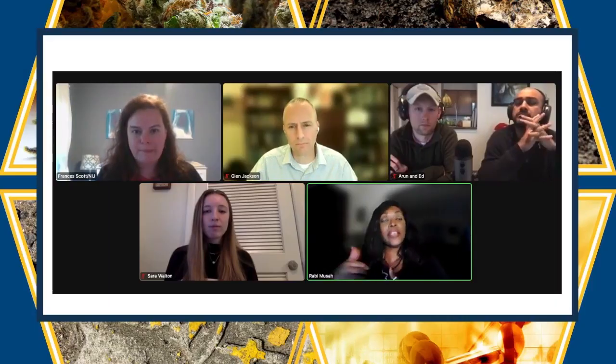And then the next tier would be where it gives you candidate structures. So the idea would be that once you reach that stage, the candidate structures are whittled down from, say, 1,000 to 4. And the 4 are typically isomers of one another. And so at that stage, it becomes fairly straightforward for you to then say, can infrared help me to figure this out, for example, based on certain features that I see maybe in the fingerprint region and that kind of thing. So that's how it would work.